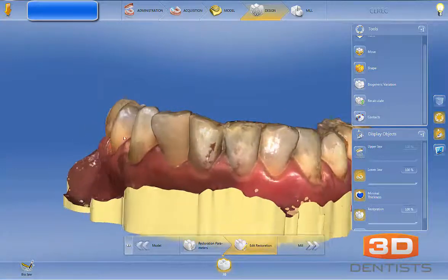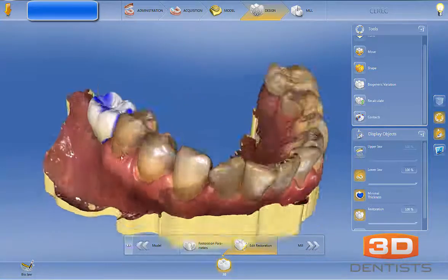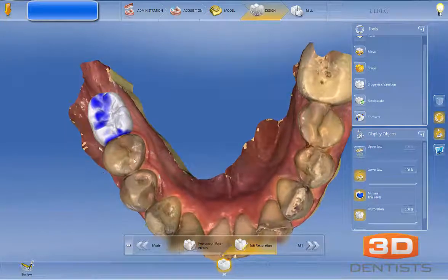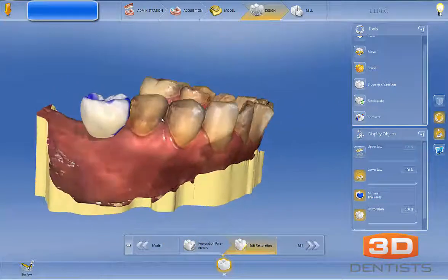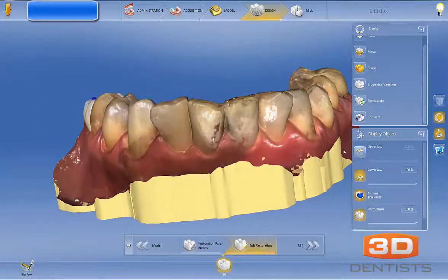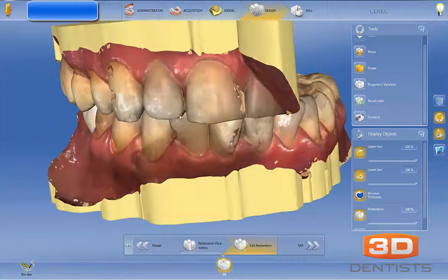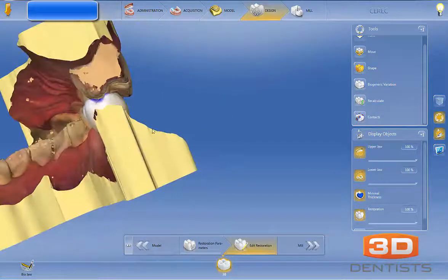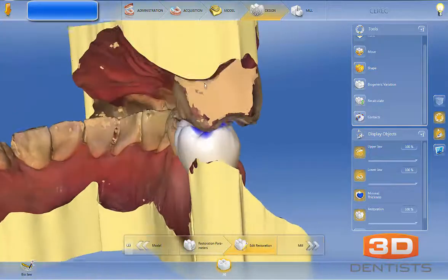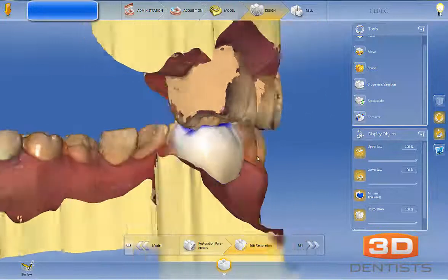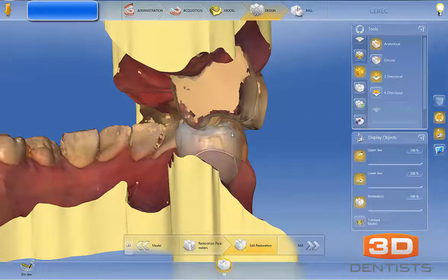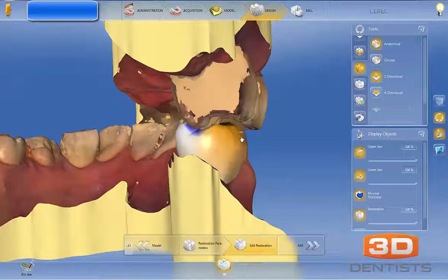One area I like to look at — and one of the common challenges I see — is oftentimes dentists aren't taking an opposing into account. Like, no big deal, I just want to design a tooth. But now when I suddenly put the opposing on there, I can see from this view that our tooth is quite a bit not buccal enough.